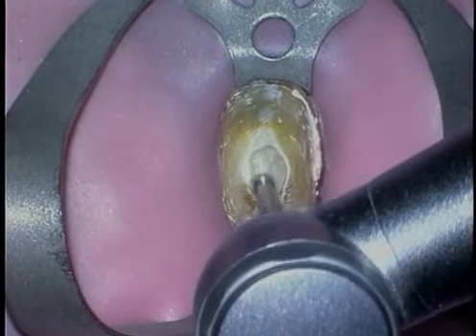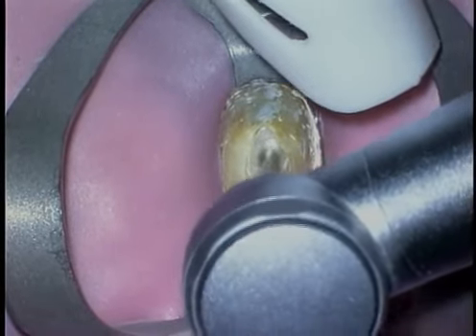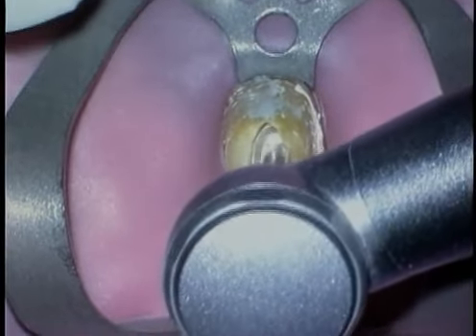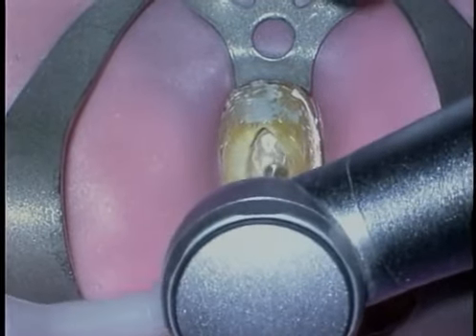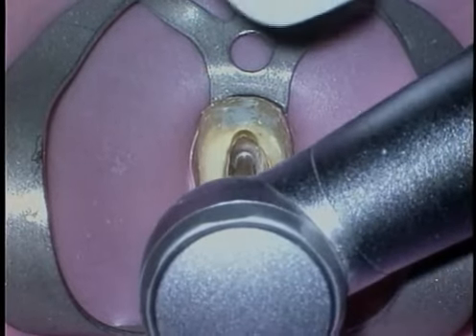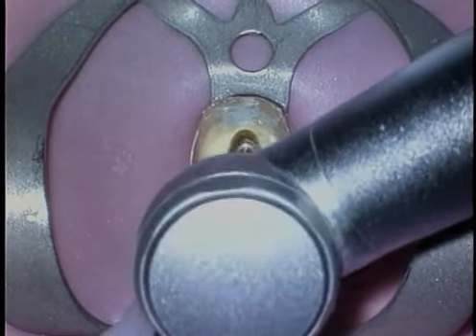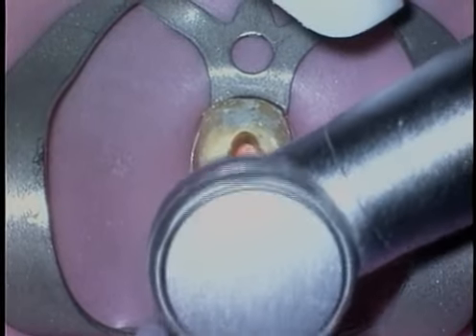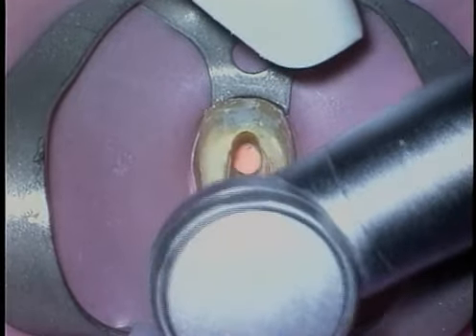This exposes as much tooth structure as possible so you can get a better read on the anatomy of the clinical crown. Surgical length round burrs are again utilized because what we want to do is have maximum vision. Their extended lengths move the head of the handpiece further away. Notice that we found gutta percha towards the buccal. Because the gutta percha is skewed to the buccal, it suggests to the clinician to move the access more to the lingual. Of course, the preoperative films guided our pathway and let us know where to look.